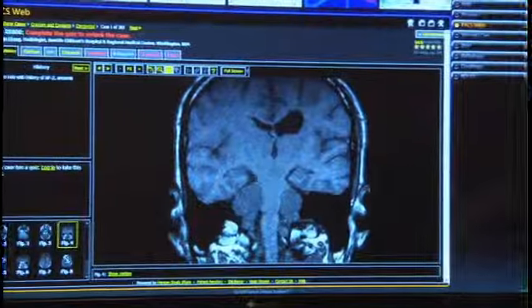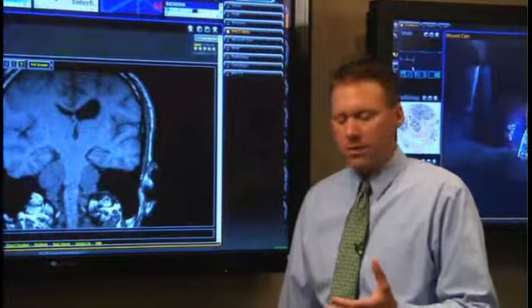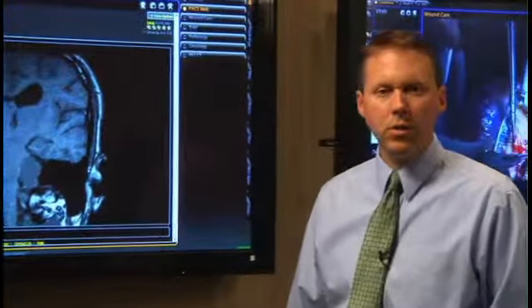Another practical application within the operating room is these private practice physicians who are orthopedics or neuro and some of the subspecialties. A lot of them have invested heavily in technology within their office. They've got a practice management system, potentially an EMR even, and an outcomes database. In some cases, they even have invested in their own PAC system.